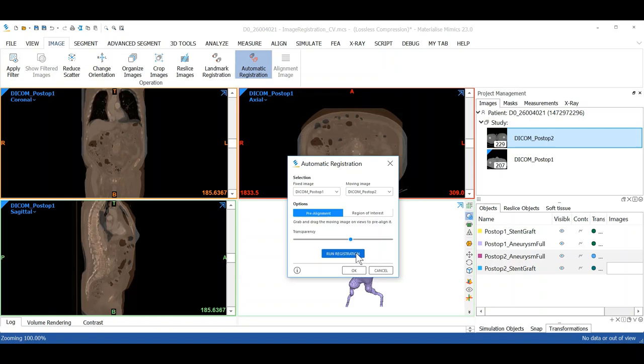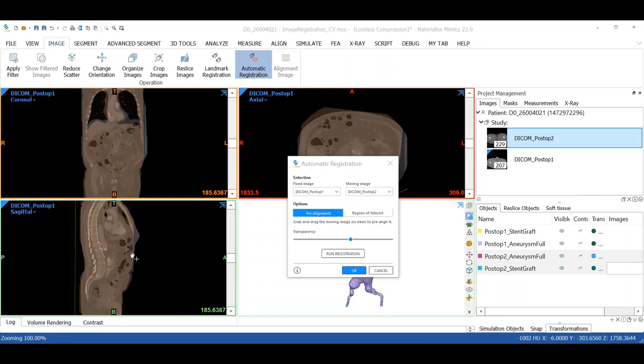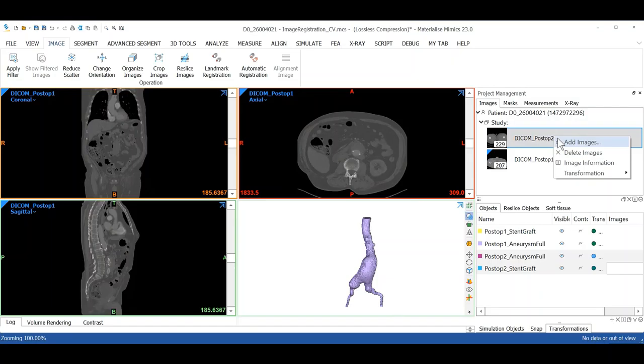All right, so we can see the result of the automatic registration tool and if we're happy with the result, click on OK. And as a result of that registration, a transformation matrix has been produced.